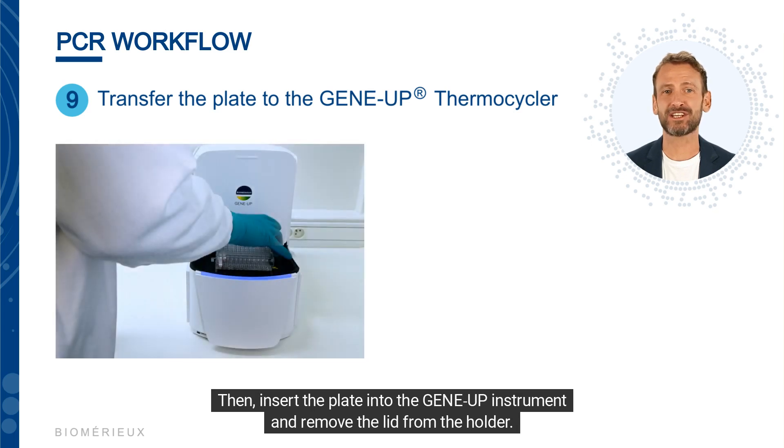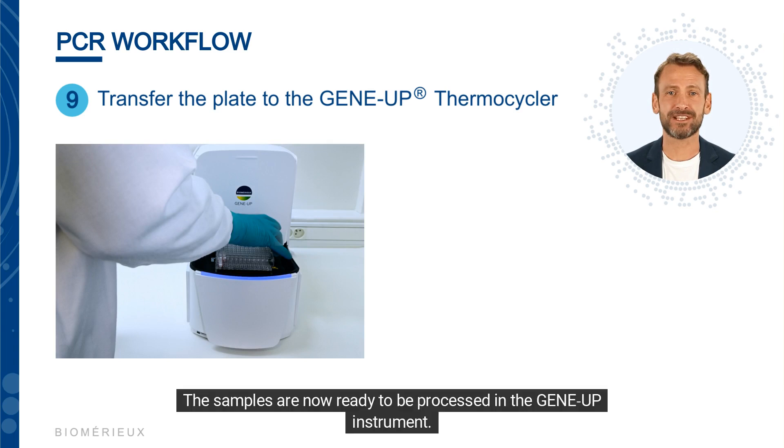Insert the plate into the GeneUp instrument and remove the lid from the holder. The samples are now ready to be processed in the GeneUp instrument.